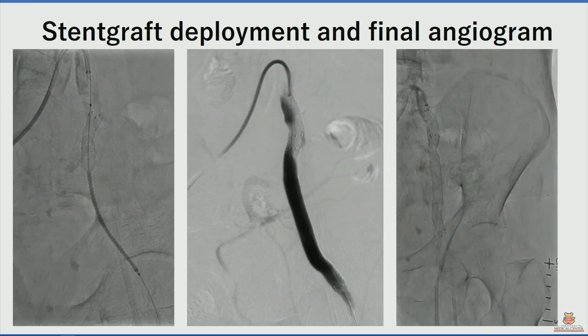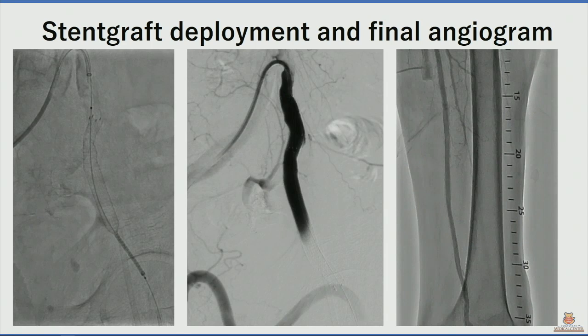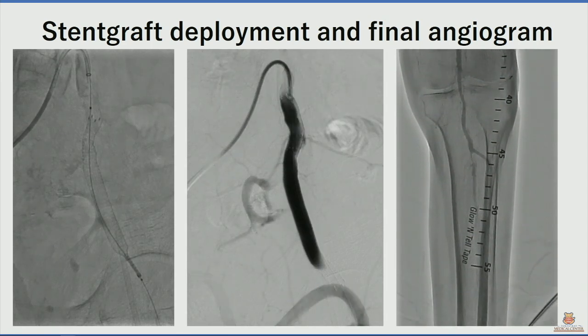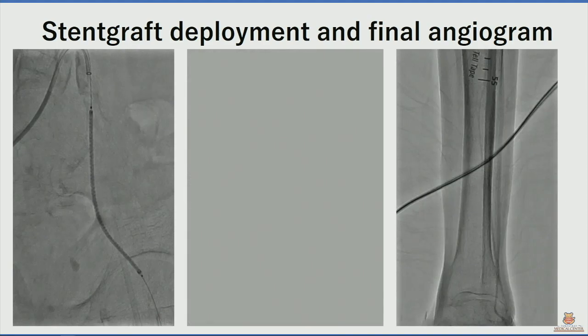This is the final angiogram of this procedure. The ligated iliac artery flow was completely recanalized. This is a perfect result.